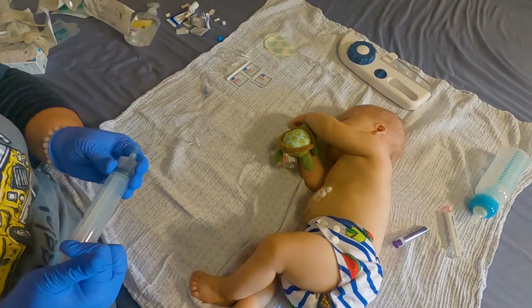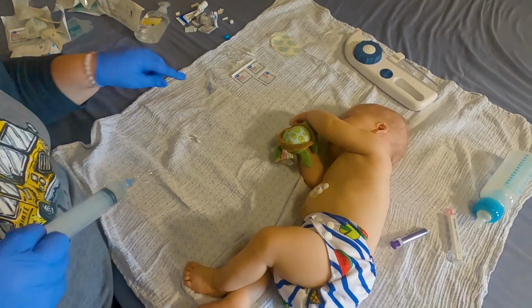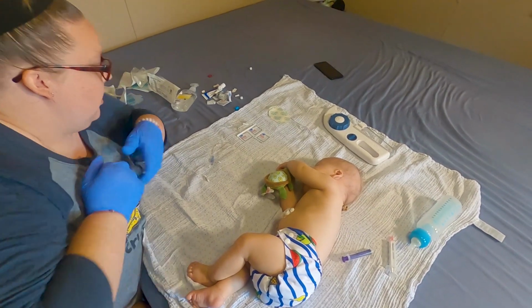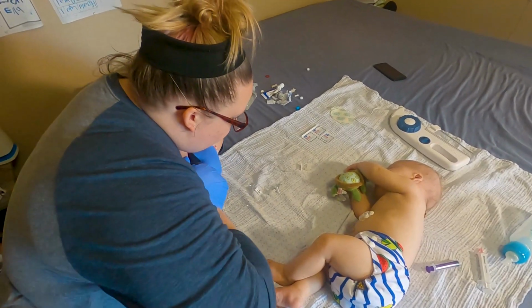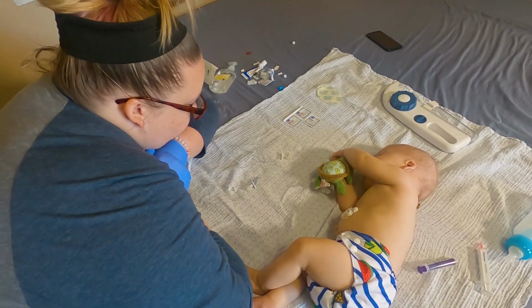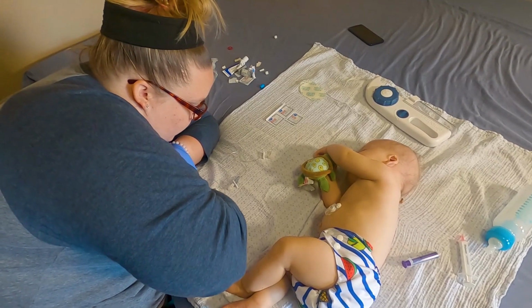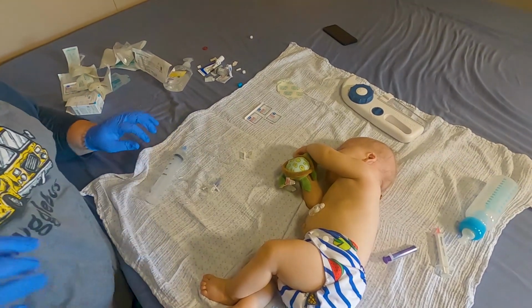Okay. It goes. And so it's all the way up here. So you want to stop it before it gets to the needle ends because his skin will react if the medicine actually touches his skin. There it is, and it's clear, going through clear. So it's kind of hard. All right, so it's right at the end.